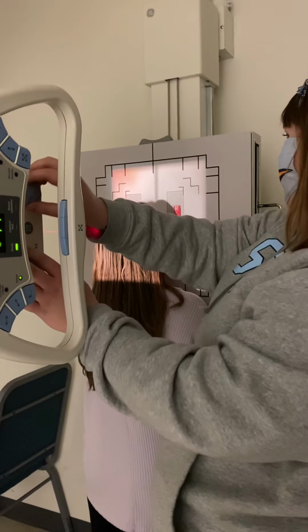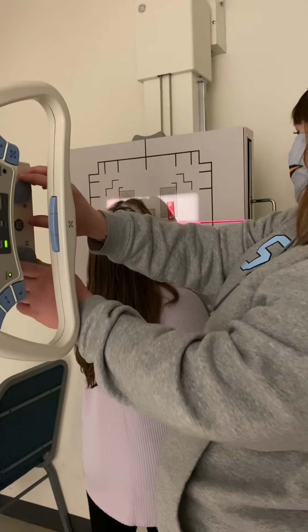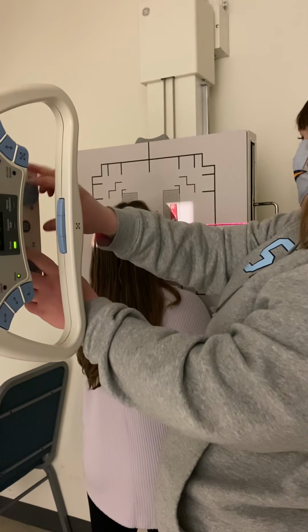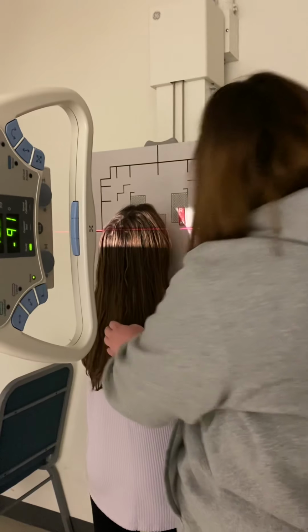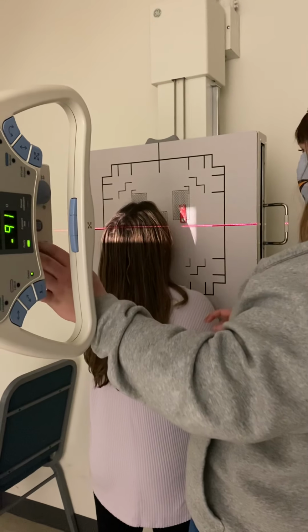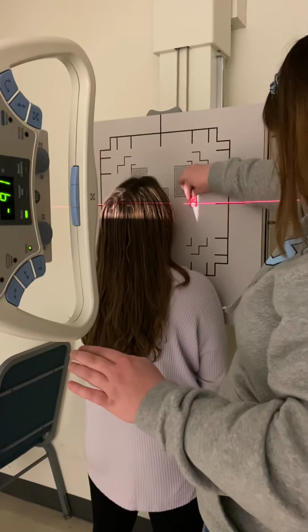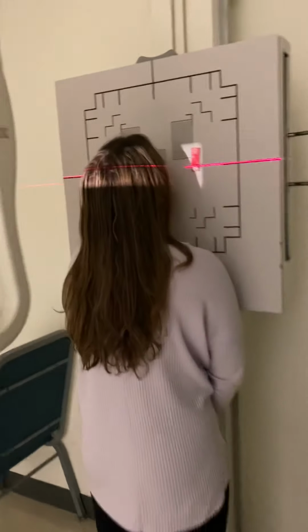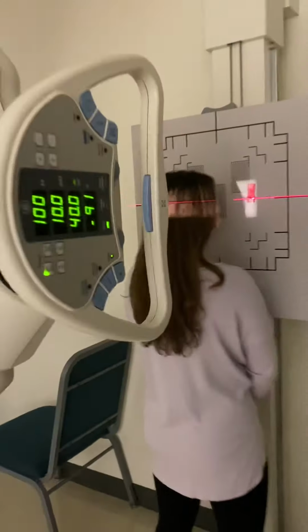We're going to collimate in to get the orbits, supraorbital margin, infraorbital margin. Going to make sure she's centered. And I'm going to have her close her eyes, hold them still, and hold her breath, and then breathe and relax. And that's the projections of the orbits.